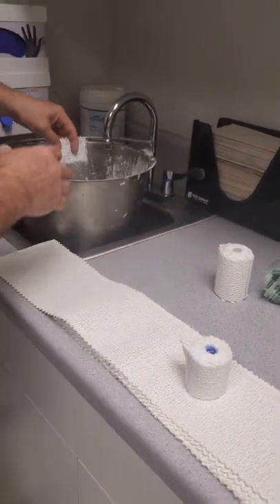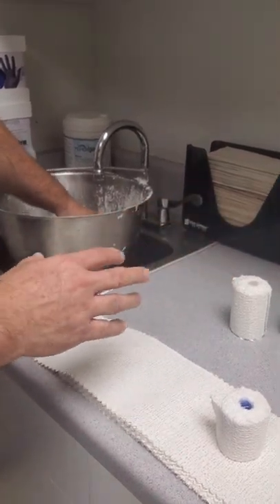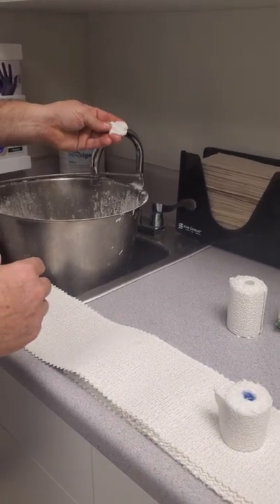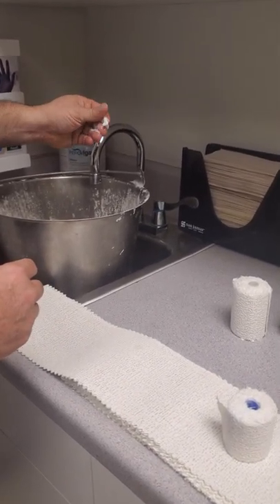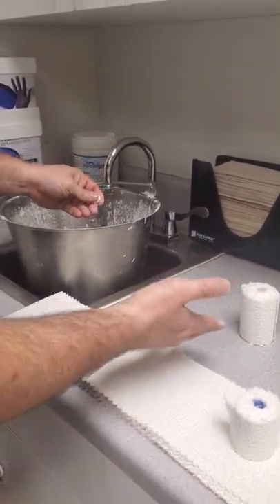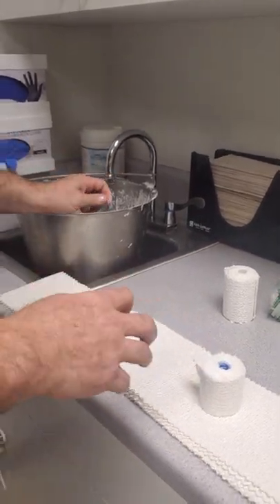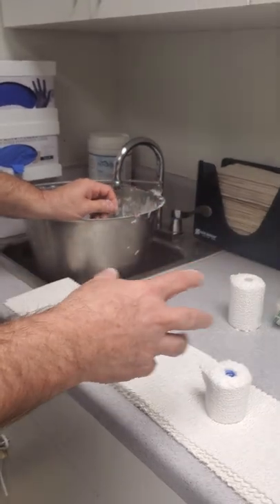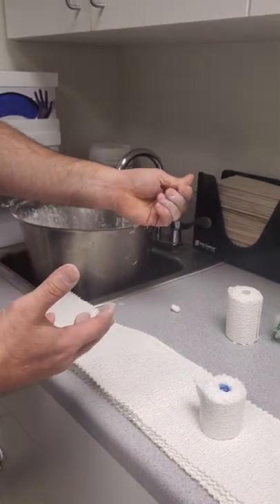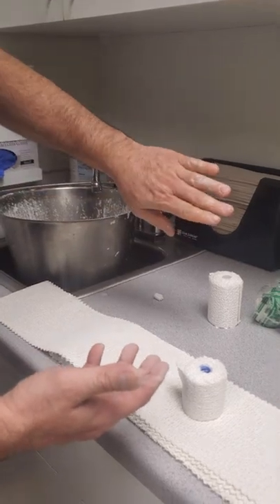We now have the plaster bucket filled with warm water. I tend to use room temperature water or just a tad warmer. Once you wet the plaster it gets all nice and milky, and you can start molding it and shaping it. The big thing we all know is when you're working with plaster, while gloves are recommended, they're not as stringently required as with fiberglass. With fiberglass you can't work without gloves. The plaster, after a few washes, you can wash it right off — it's just like working in eighth grade art class.